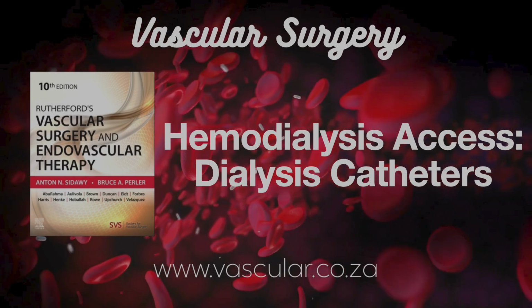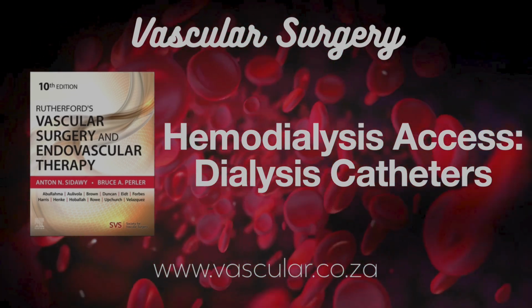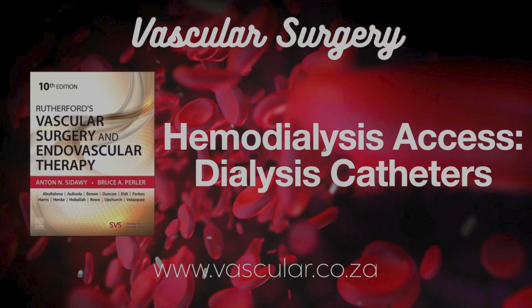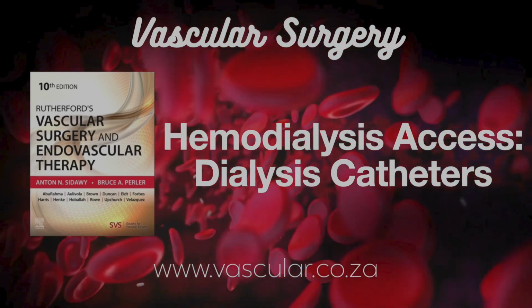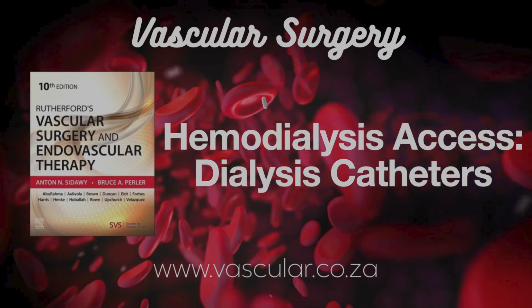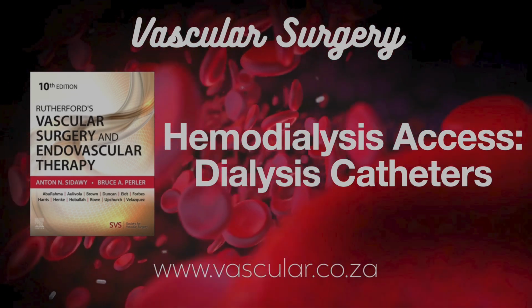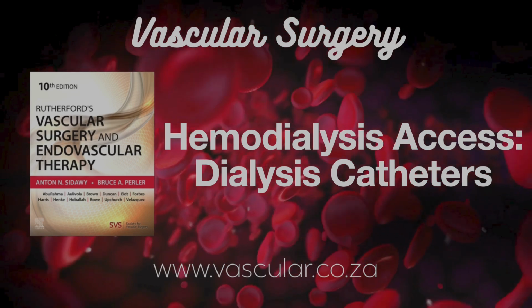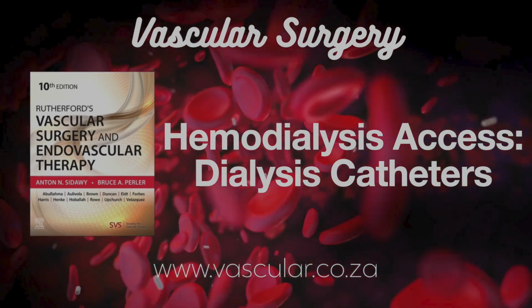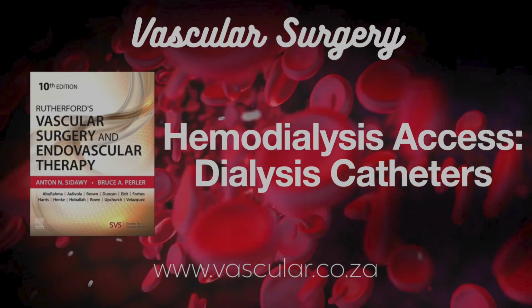You mentioned coordinating care earlier. That sounds critical here, right? Between the person putting in the TDC and whoever might do a permanent access later. Absolutely vital. Think about it. You've only got a limited number of good spots to put these things, both temporary and permanent. Right. You don't want to burn bridges, so to speak. Exactly. So having the same team, or at least a really well-coordinated plan, helps preserve those precious access sites for the long term.